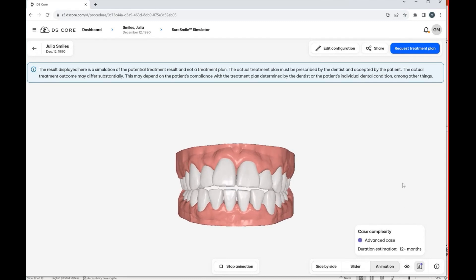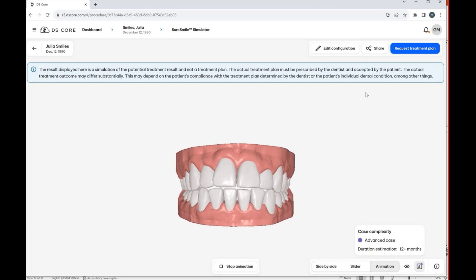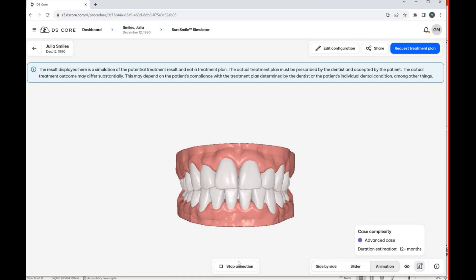within a minute and a half, you can have this ready to go for a patient in a consult, a new patient exam. And that's the new SureSmile simulator from DSCore. Thanks so much.